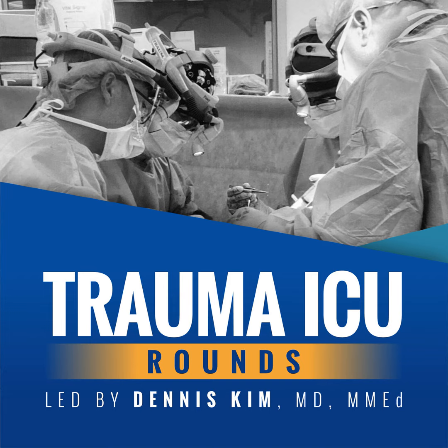And then finally, in the MICU or mixed med-surg ICU, where patients may be admitted with a primary acute respiratory acidosis or acute on chronic respiratory acidosis in the setting of a severe COPD exacerbation or asthma exacerbation, it's important in these patients to not just offload the muscles of respiration, but to use the vent to help correct any severe acid-base abnormalities due to an acute or acute on chronic respiratory acidosis.